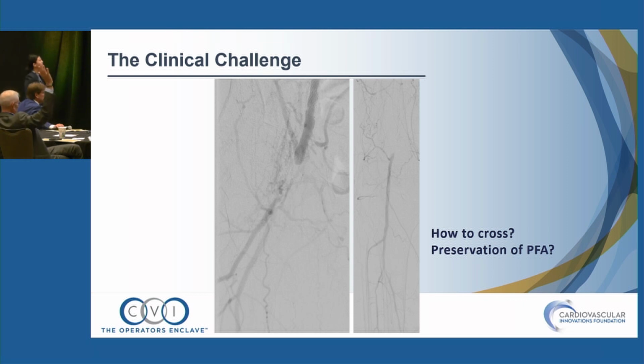If you don't mind, Jun, because this is a great discussion, I'm going to ask Dr. Eidt, is it true that you have to go back surgically? I guess the question for me is that sometimes we do endo and it fails, and maybe we need to do surgery and not another endo. In other situations we go surgical and the surgical approach fails, maybe for technical reasons or some other issue. So what is the need? Is it gospel that we have to go back to surgery? What are your thoughts about a situation like this?